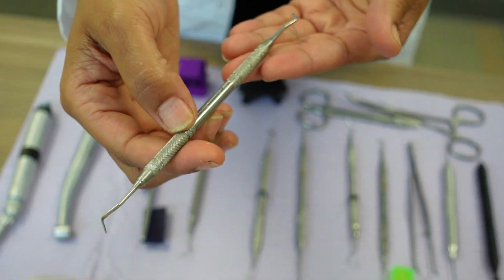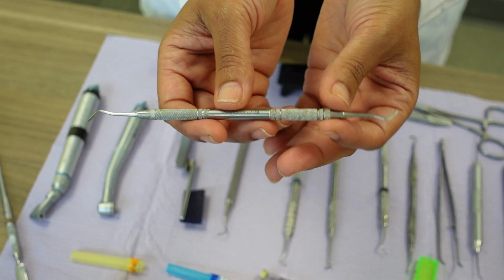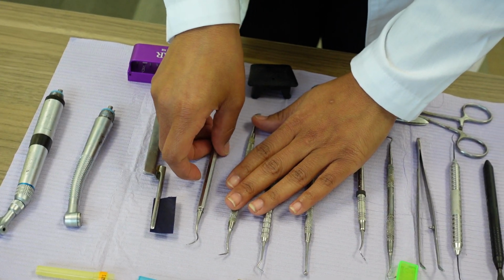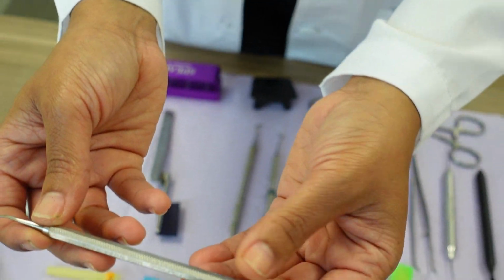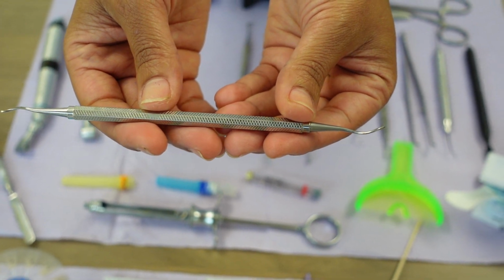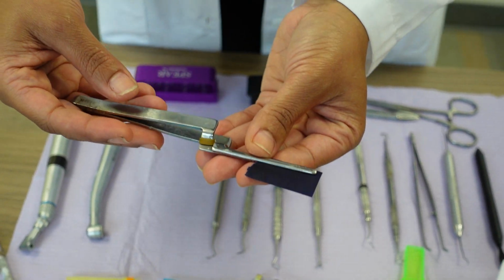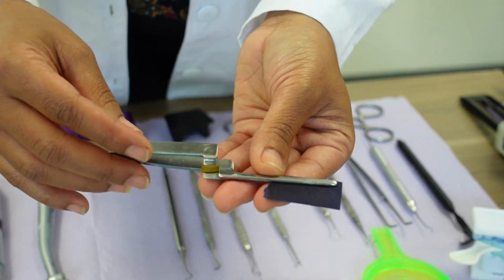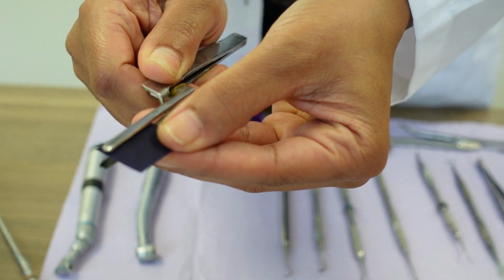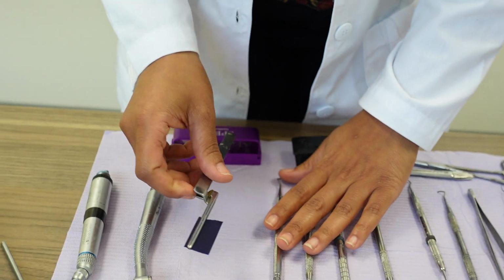We have a carver, which is used to remove excess material in between the teeth. Another word for that is interproximal. Here is a scaler used for extra access. Any extra material that's on the tooth, it pops off for us. We also already went over the articulating forceps. We have articulating paper. We open it, we close it. Those are used to check the occlusion.